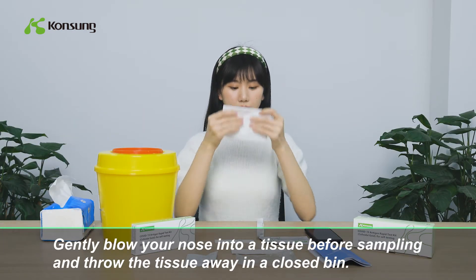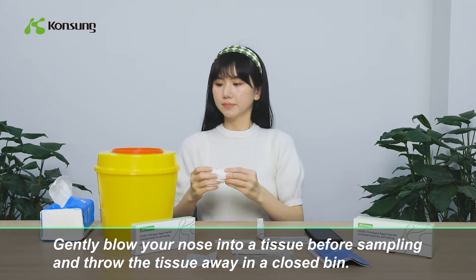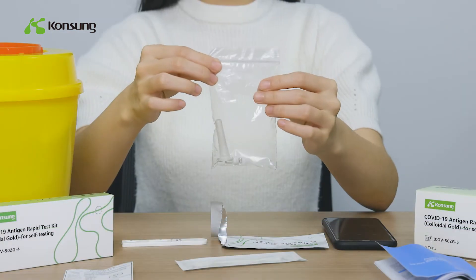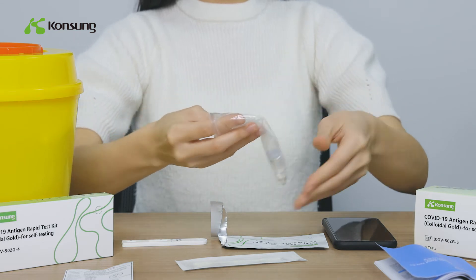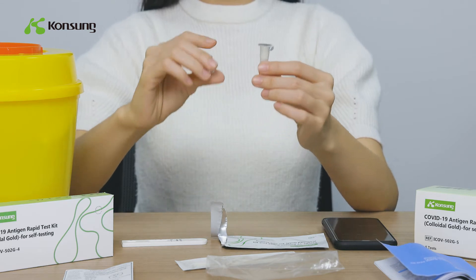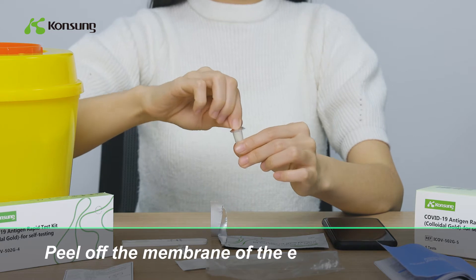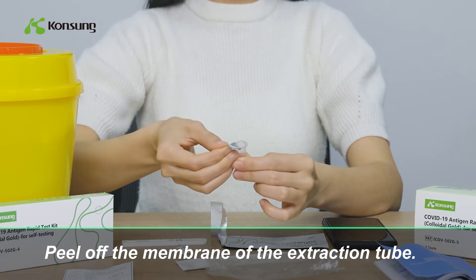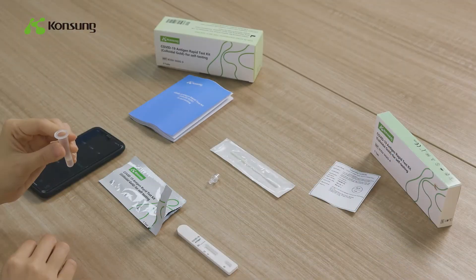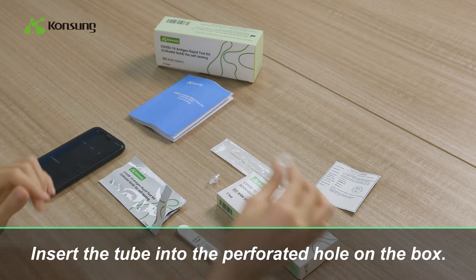Gently blow your nose into a tissue before sampling and throw the tissue away in a closed bin. Peel off the membrane of the extraction tube and insert the tube into the perforated hole on the box.